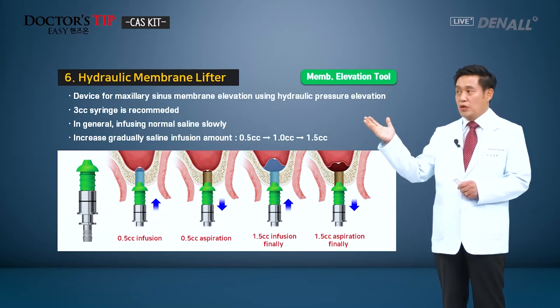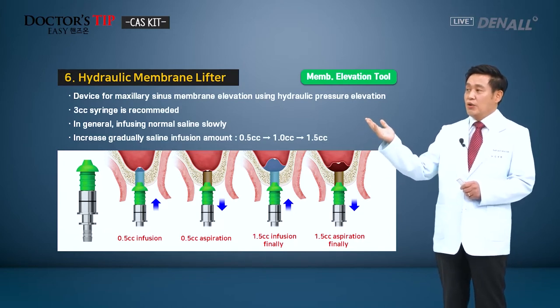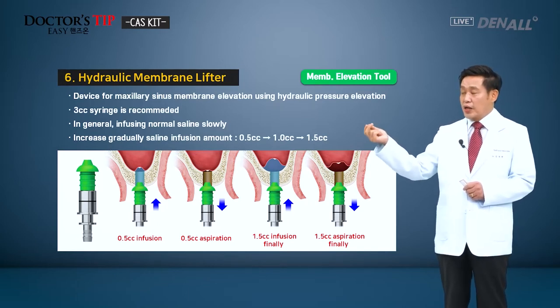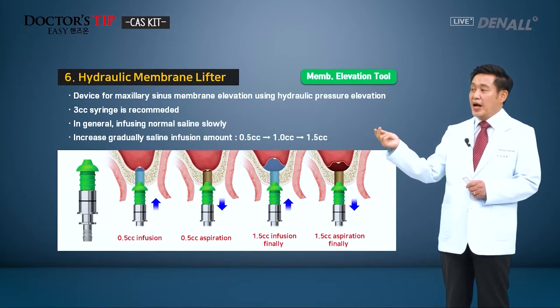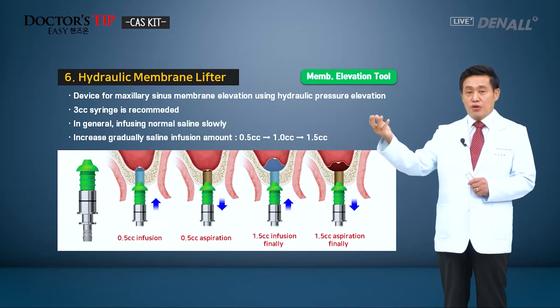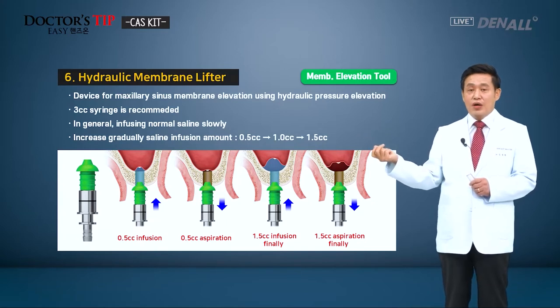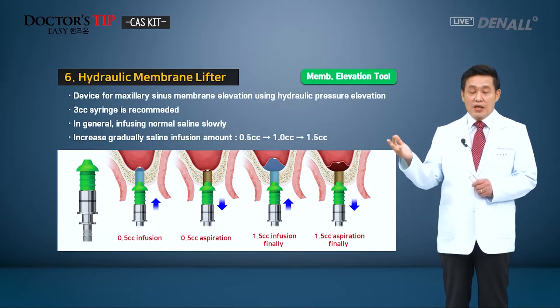In general, normal saline is infused, but not all at once. The silicone part should be adapted to the drill hole so the saline is not leaked. First, you need to infuse 0.5 cc and aspirate. The blood inside can be suctioned out. If there's no membrane damage, you will be able to feel the negative pressure. With a crestal approach, it's basically a blind approach, like a conventional osteotome.